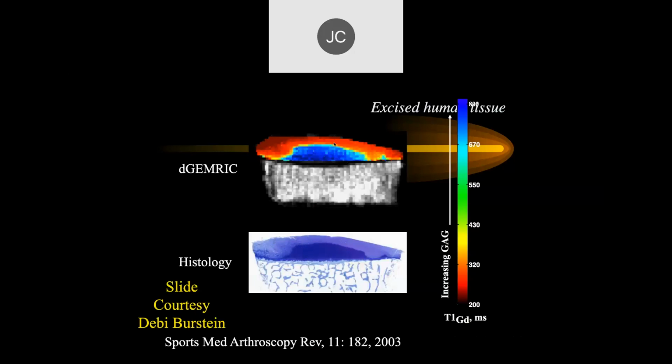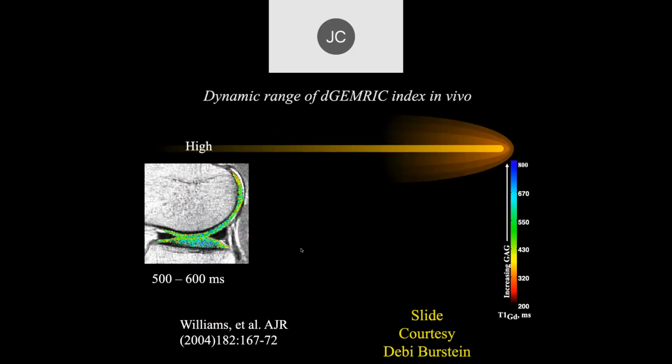This shows a measure of the extent of signal change due to the contrast enhancement, and she correlated that with biochemical analysis of the different areas of the articular cartilage, so she could generate a scale where the signal intensity within the dGEMRIC technique correlated with the concentration of glucosaminoglycans within the articular cartilage.